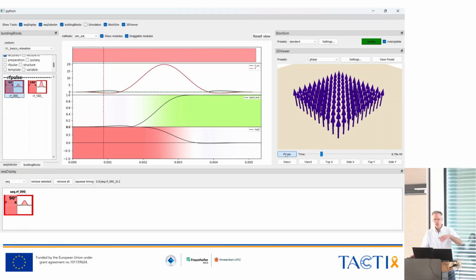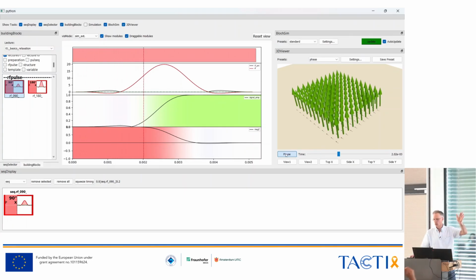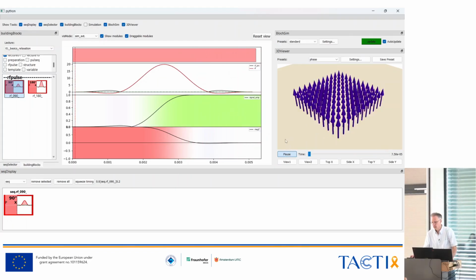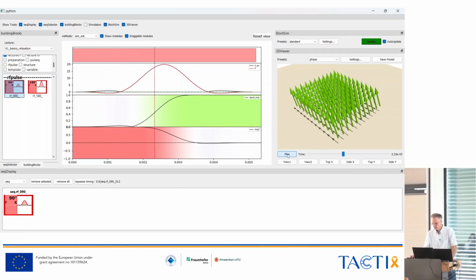You can just go through what happens to your magnetization, and you see the magnetization flipping around to transverse magnetization. So it's relatively simple. I think that's it for now.